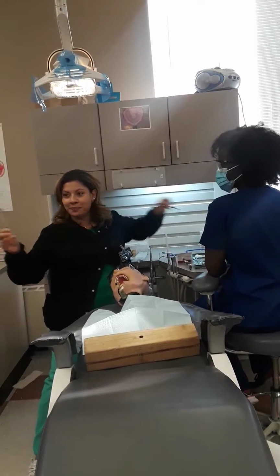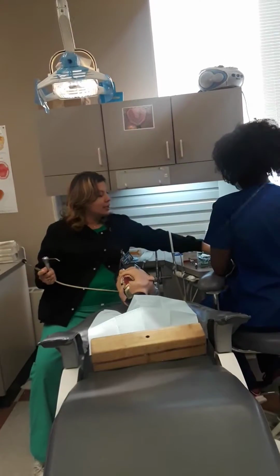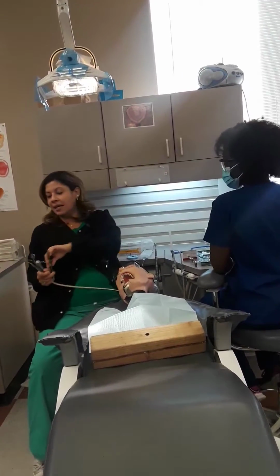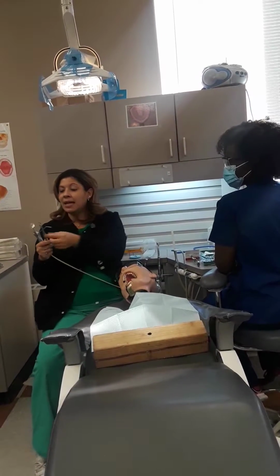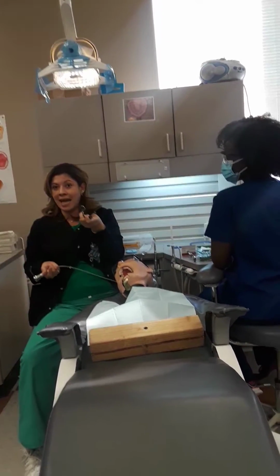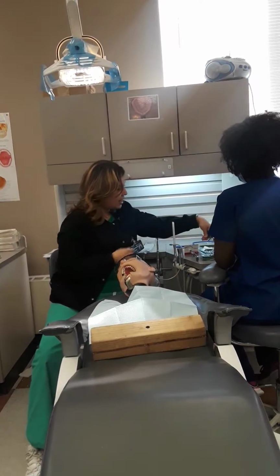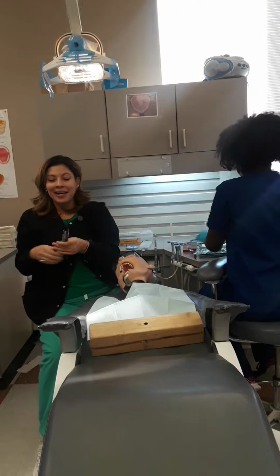So we got a mirror, explorer, my air water syringe, cotton pliers, and articulating paper. This is a basic. Okay, this is what we call basic. They are labeled blue, so they're always going to be together in the setup. So that's what it asks for. So those are all those that we need. And then she asked, oh, will you put those back in order? I'm going to take them off.